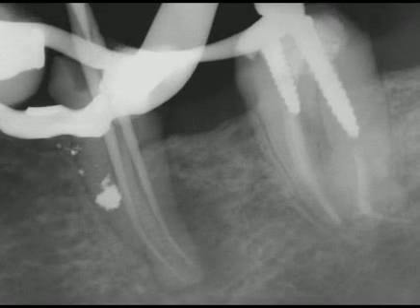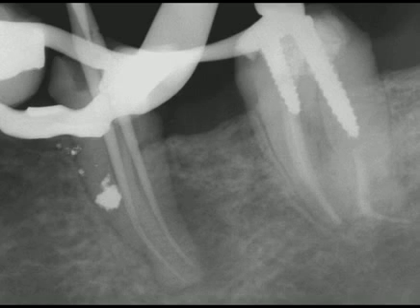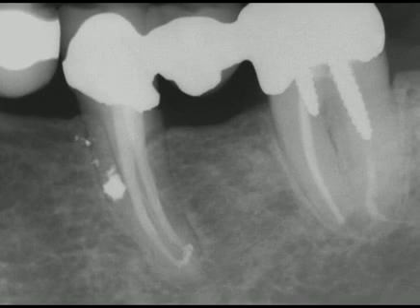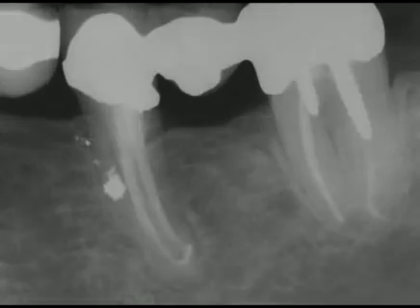This working film shows 2 gutta-percha cones at length in the MB and ML systems. A post-treatment radiograph reveals 3-dimensional retreatment. Note the 3rd mesial system between the MB and ML canals with its own apical portal of exit. The 8-year recall film demonstrates a new bridge and excellent periradicular healing.